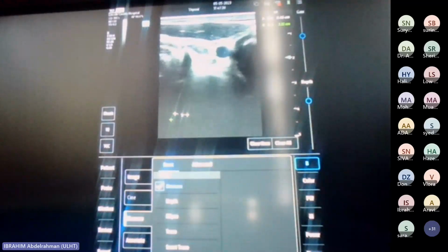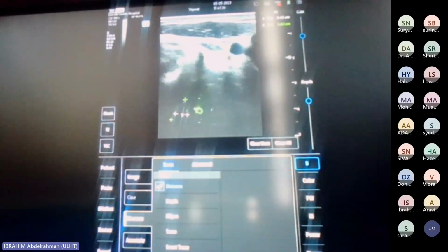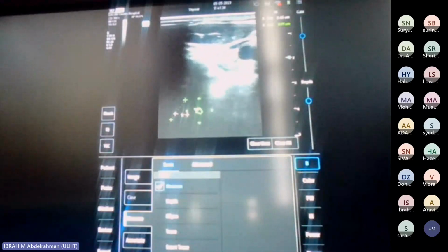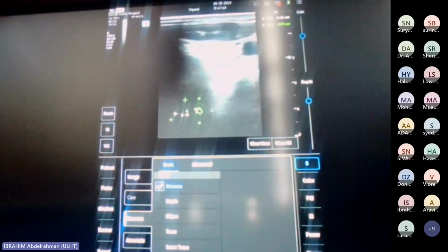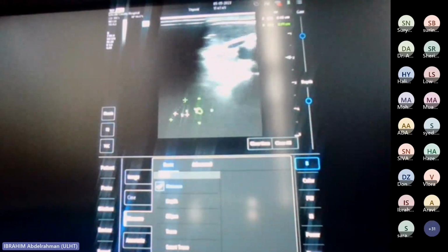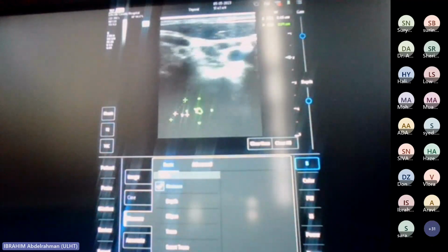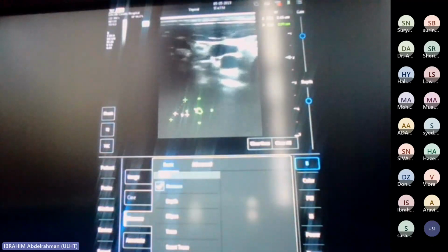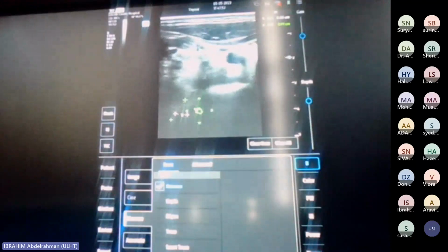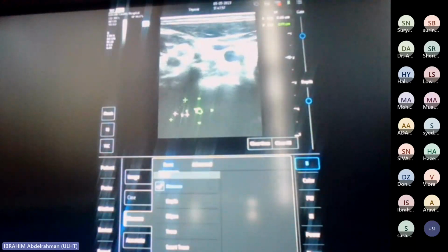So here's the vagus nerve, across the sheath, the carotid artery, and the internal jugular vein. Take some of your pressure off the probe and you'll see the vein fill. One of the things you need to be careful of when you're doing a biopsy is that you don't collapse that down too much and think, oh, I'll just put my needle through there, and then realise that you've gone through the IJV. It's the same with the external jugular vein, which is sometimes very superficial. So that'll be this part, the scalene muscles.